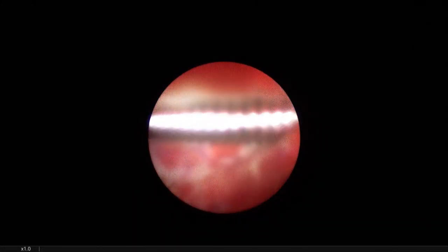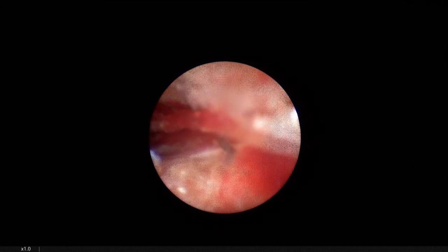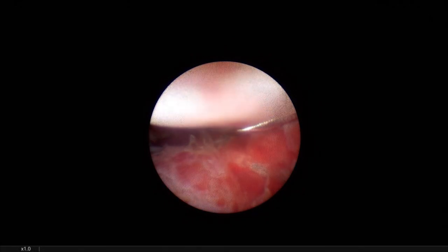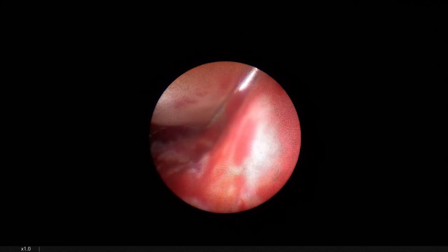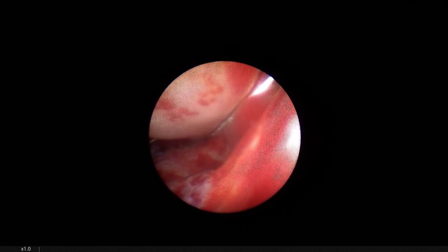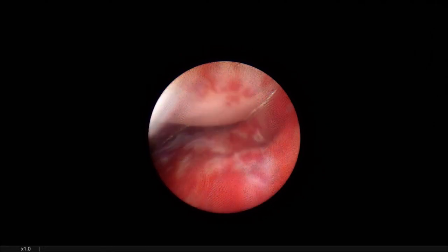This is my entrance to the stone. There's my entrance to the stone. This is not possible to enter from this position. Okay? We make a second dilation.